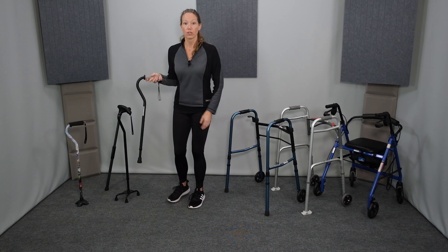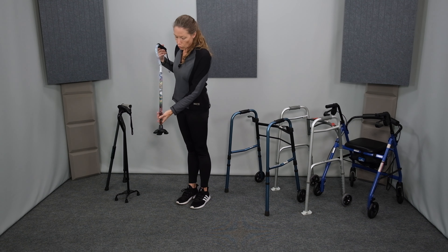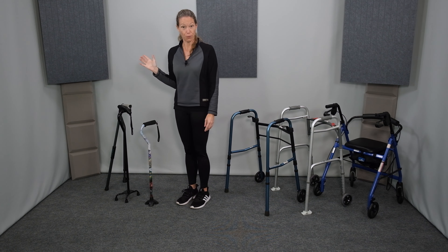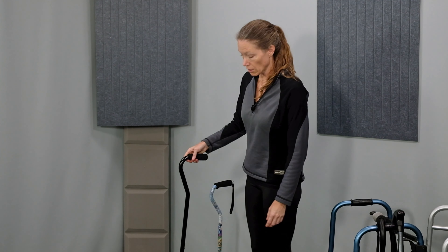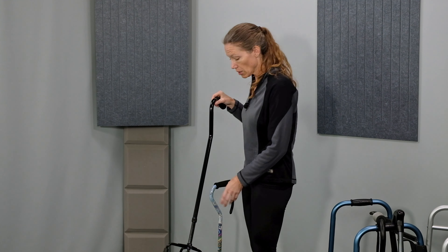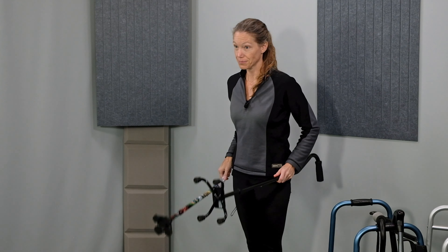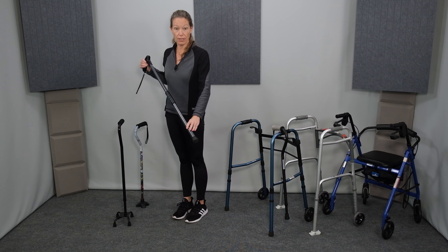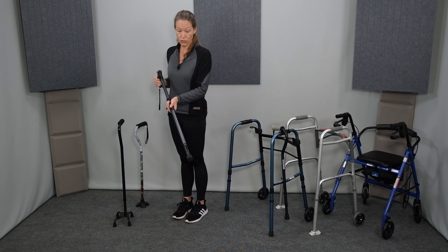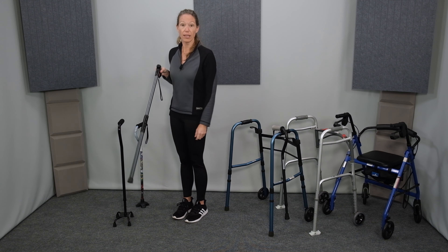This is an offset cane, also called a single point cane. This is a single point cane with a quad tip — this tip is added onto the bottom of the cane to allow it to stand up on its own. Next we have the narrow based quad cane. This style has four points on the bottom and provides more support than the single point cane with the quad tip because those four points create a much wider base of support. Finally, the handy cane combines a straight cane with a reacher — pull up on the grip and engage the trigger and a reacher comes out the bottom, great for picking things up around the house, then put it back into cane position.